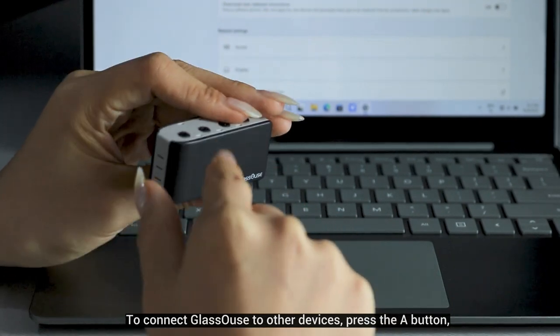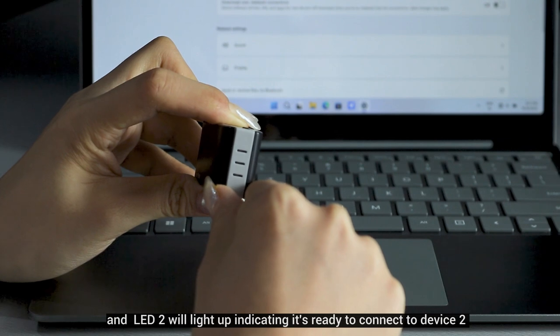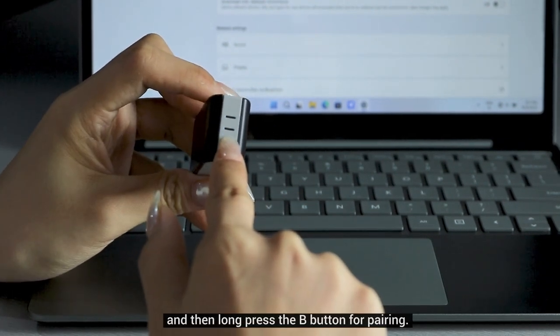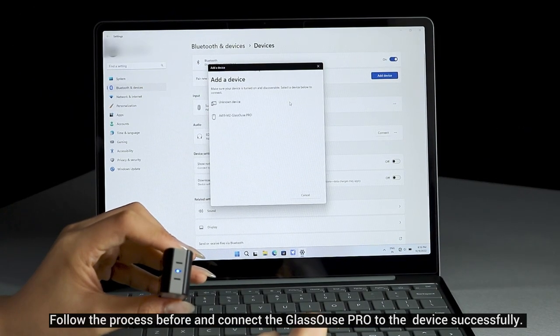To connect GlassOuse PRO to other devices, press the A button and LED 2 will light up indicating it's ready to connect to device 2. Then long press the B button for pairing, follow the same process as before, and connect GlassOuse PRO to the device successfully.